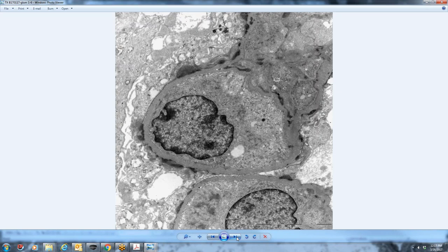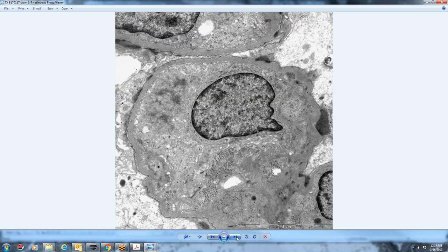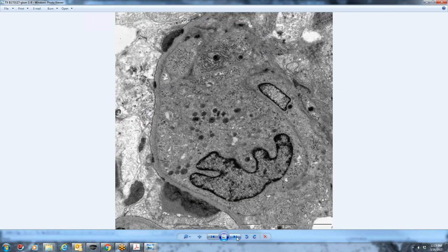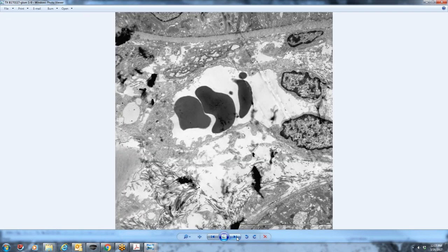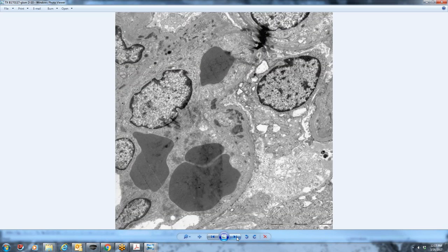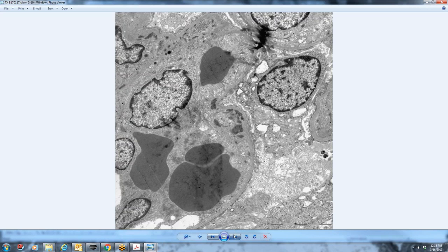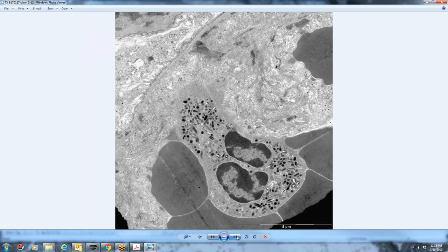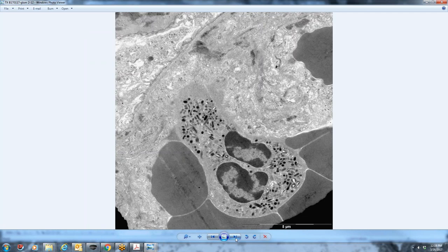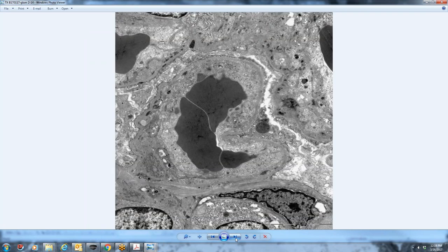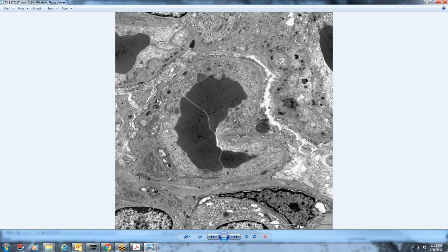In the second glomerulus, it's actually more of a straightforward sub-endothelial immune complex deposition. So the humps aren't present in the second glomerulus. They're more commonly within the sub-endothelial mesangial zone. This is just to show that there's even circulating granulocytes within the capillary loop.